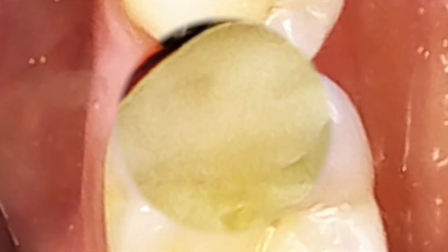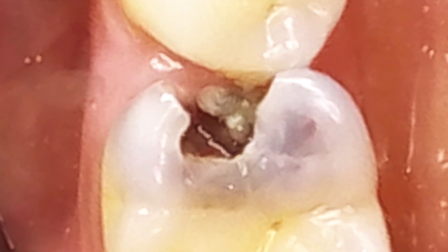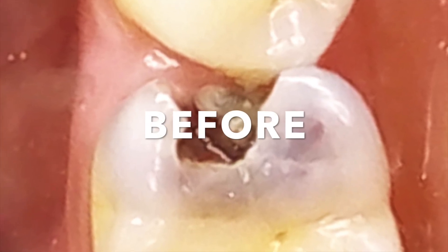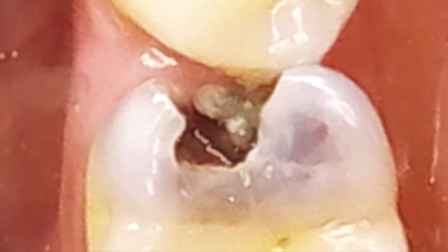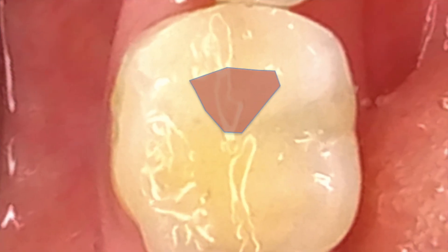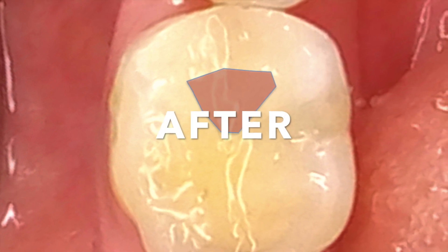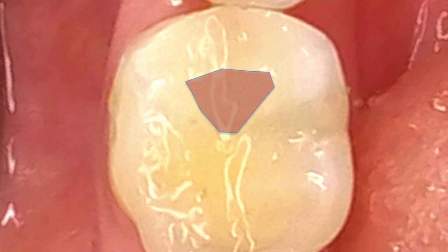This pictorial guide was done to show the importance of caries removal and margin sealing when faced with an endodontic treatment of a pulpally involved class 2 cavity. Until the next visit, the teflon will act as a space maintainer and can be easily removed when you reopen the access.